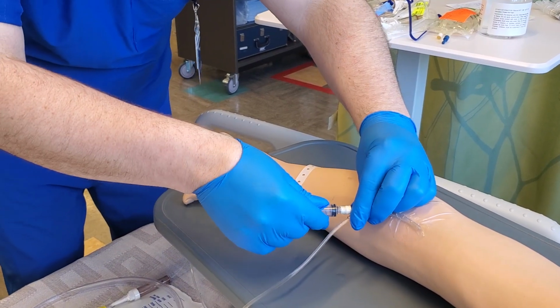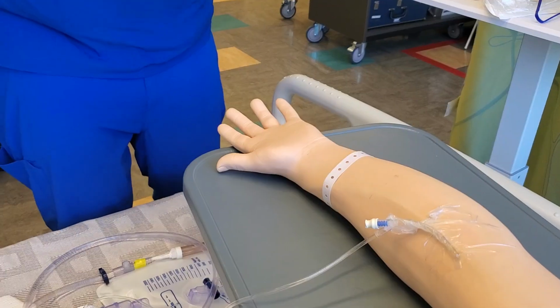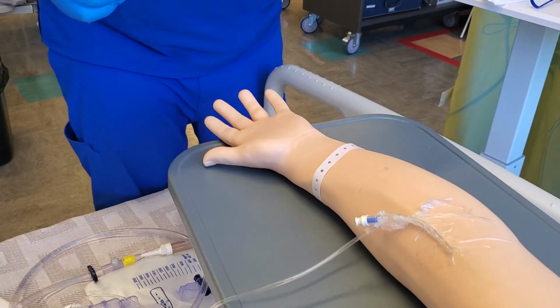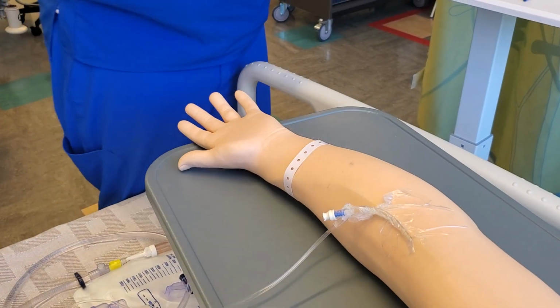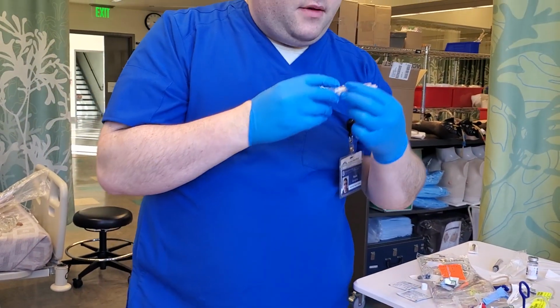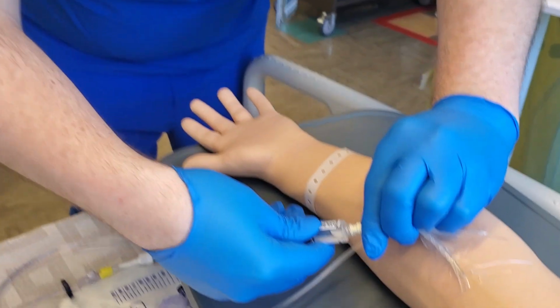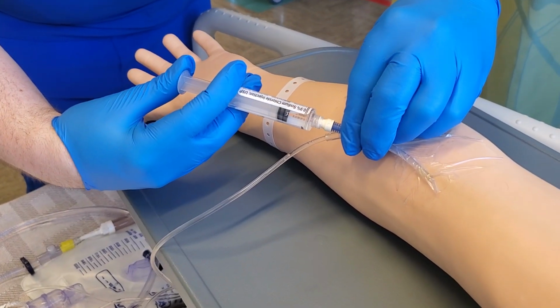Good, again, checking for any inflammation, infiltration going on. And then we'll go ahead, we'll just say this is a new one. We'll scrub it again. And then we'll go ahead and let's just use the rest of this here, the rest of the 5. Over 2 minutes.